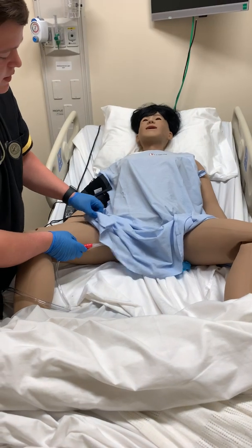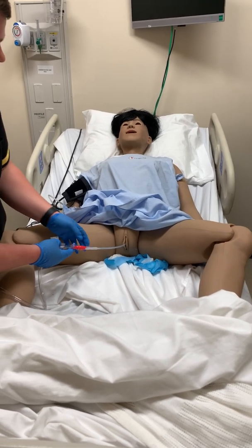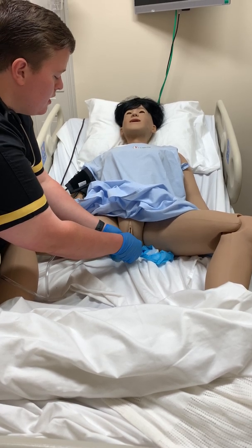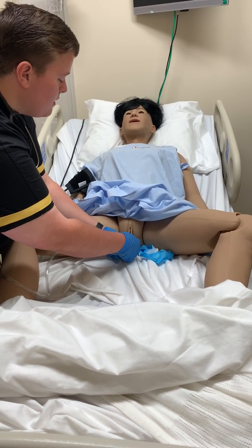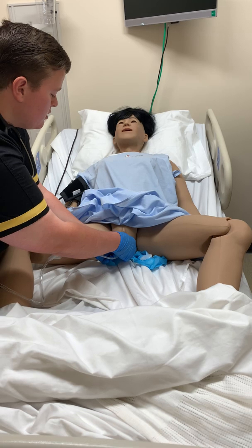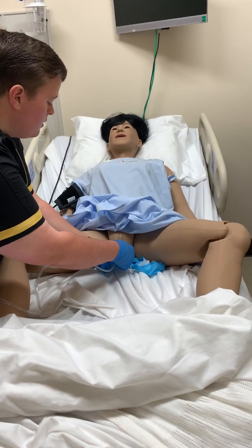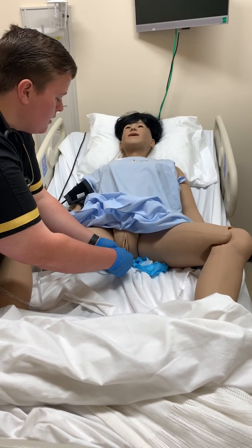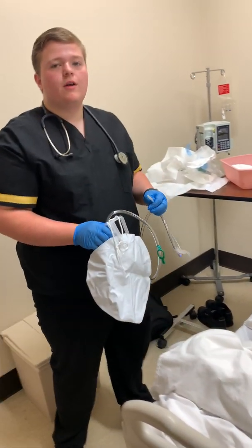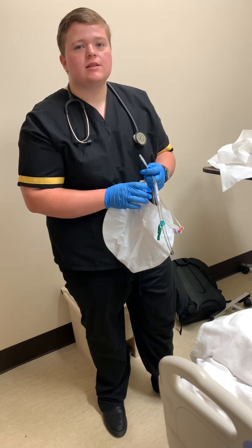And what we can go ahead and do is pull like this and remove the tape from the thigh. And what we want to do is slowly discontinue the catheter. And Ms. Smith, if the pain gets too unbearable, if it proceeds beyond mild discomfort, I want you to let me know. You're going to pull slowly but steadily. Make sure to never let go of the catheter. And there we are. You can take this now, remove it from the bed frame, and discard of it appropriately. And that is how you insert and discontinue a urinary catheter.